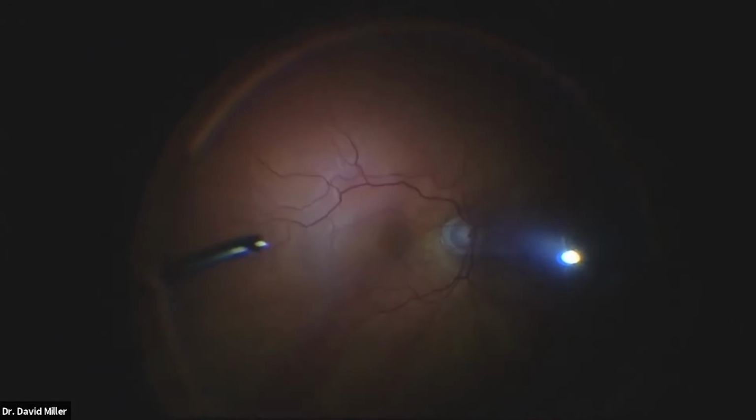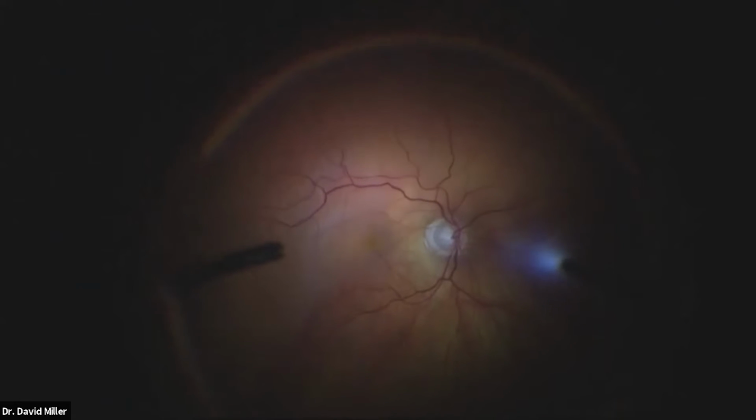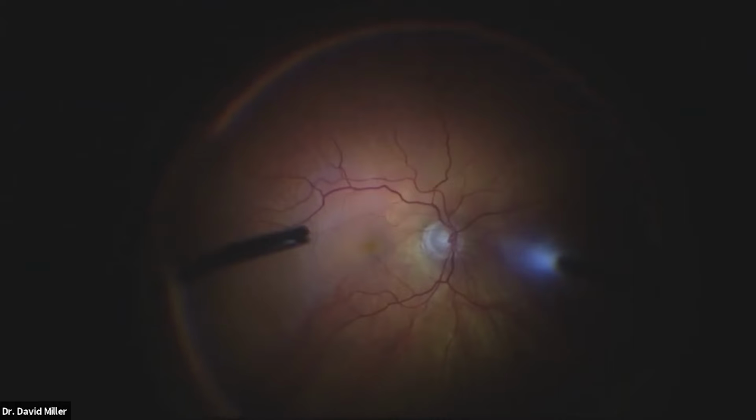There we go. Now we're going to get this focused up for you and get you a nice magnified view. How are we doing there, Mike? Pretty good? I think it's pretty good on the screen. Lawrence, if you think we need more zoom or something, just let me know, of course, during the surgery.